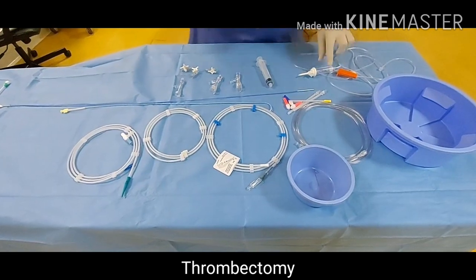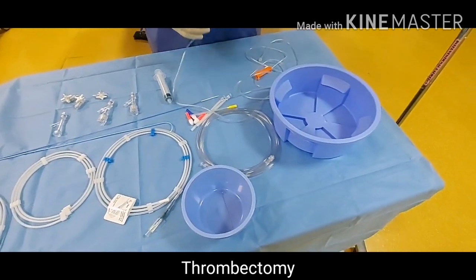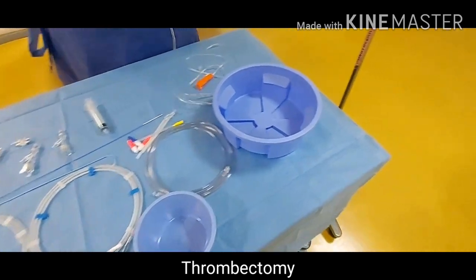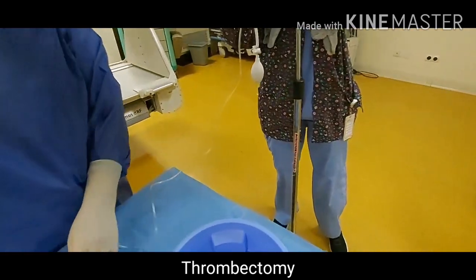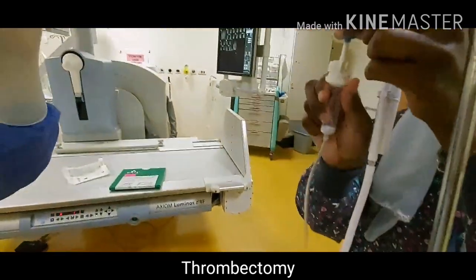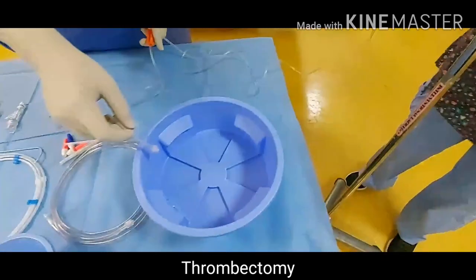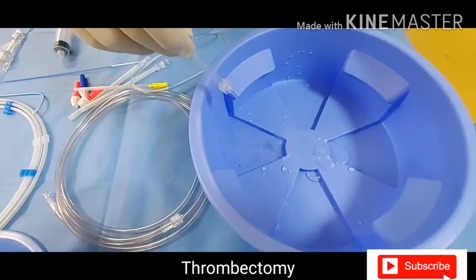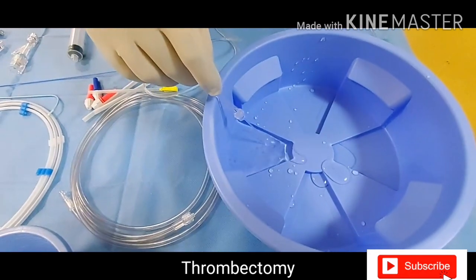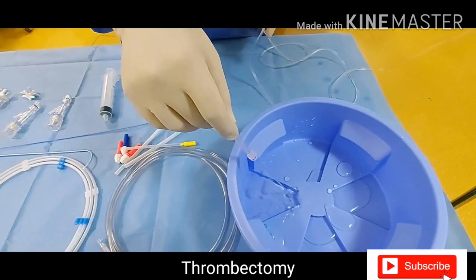First of all, we need to prepare this saline bag without any bubbles to prevent any air embolism. We have already pressurized the bag with so much pressure. Make sure your IV line is without any bubbles — good, it is ready.